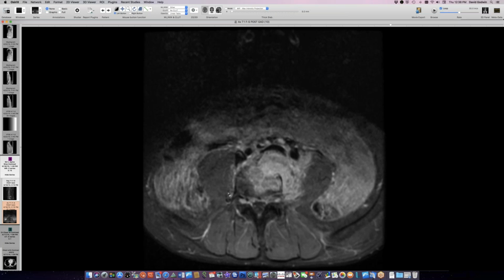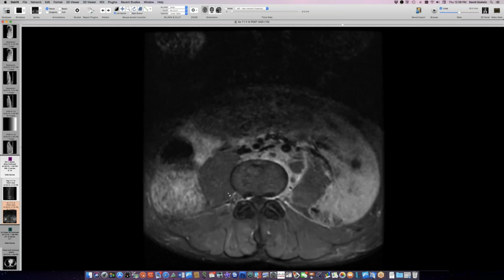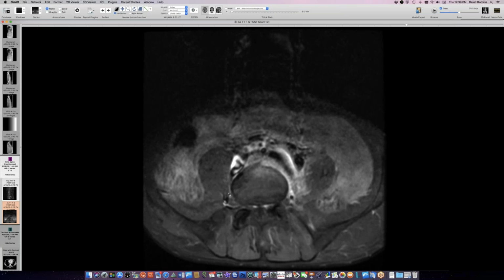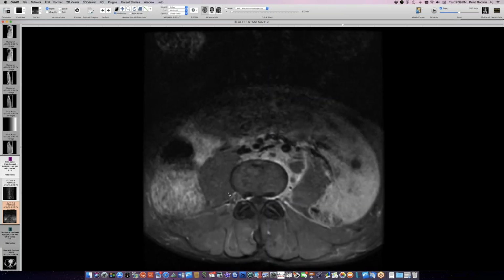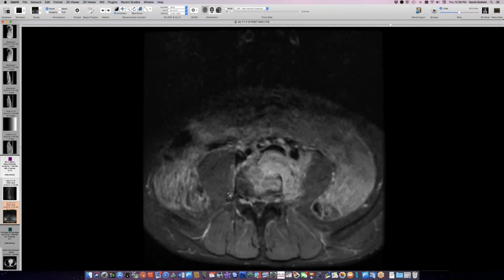So we see Coxy look a lot like TB in terms of having lung disease, in this case even miliary disease, lung cavities, low attenuation lymphadenopathy, and it likes to disseminate and cause bone disease too, which we have in this case. So a lot of similarities between Coxy and TB. And it's thought that dark-skinned people, including Mexicans and particularly Filipinos, are particularly susceptible to Coxy. So in the Central Valley in California, there are big Filipino populations, and that's where valley fever is, and so they get particularly hard hit. Oh, the other interesting thing is he had some swallowing difficulties.